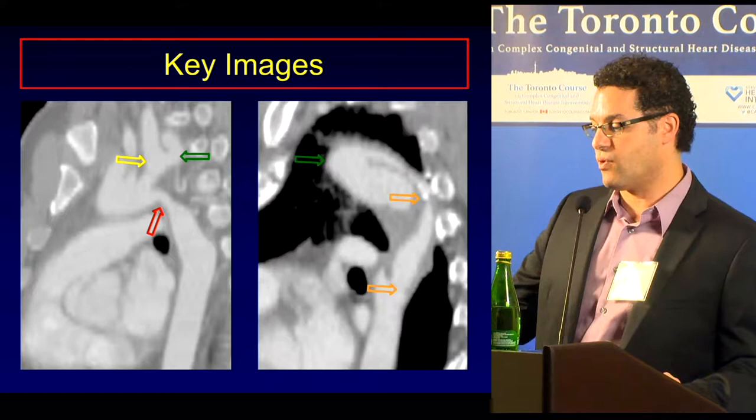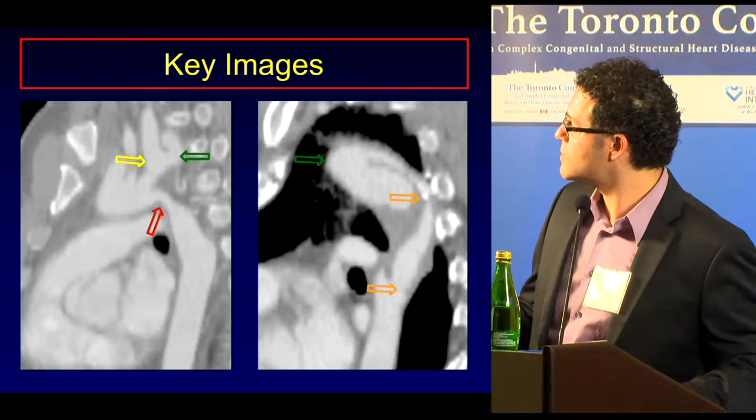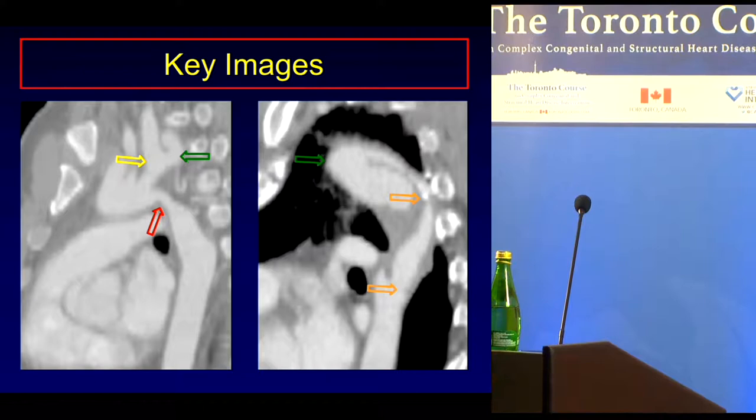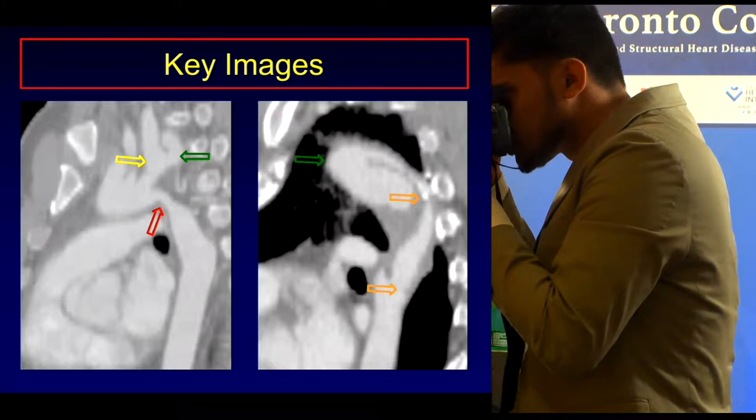What I want to do is set the order first, and I'll worry about the other thing later. So you want to deal with this? Where? Tell me where to stop. Here, come here. So this is the subclavian, right? It comes off the subclavian, right? So right there is the subclavian actually. Up and over. So that's the subclavian going up? Yes. So maybe this is the beginning of the graft, the pseudoaneurysm. Yeah. So I guess the question is now what to do with the reconstruction.